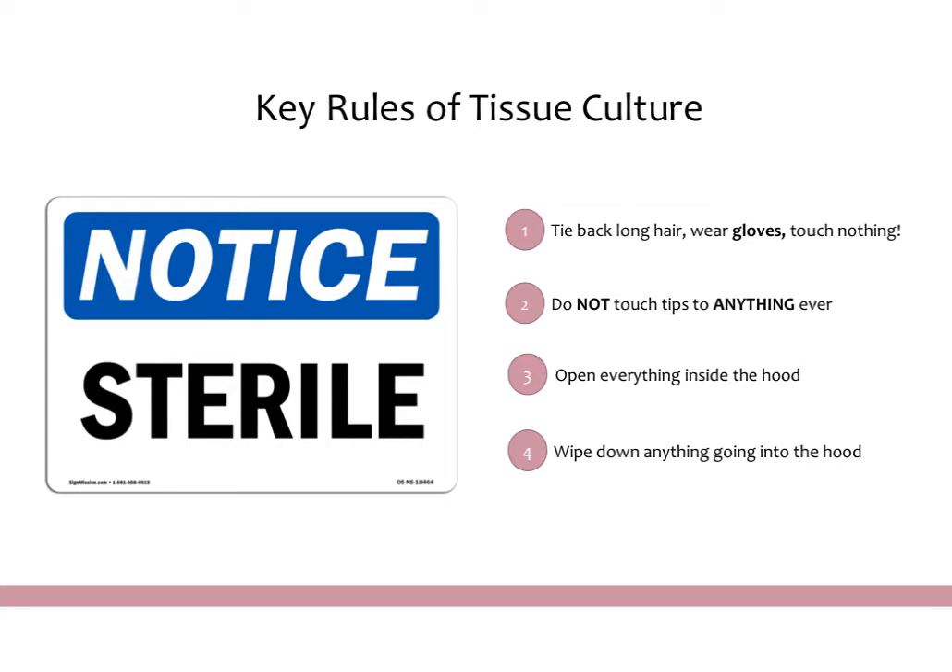Some important things to know before you go into any tissue culture room: the key thing about tissue culture is that the room is extremely sterile. You never want cells to get contaminated, and they do get contaminated very easily because they are growing in very rich media and bacteria like that media. So you have to take a lot of precautions to make sure that nothing gets contaminated.